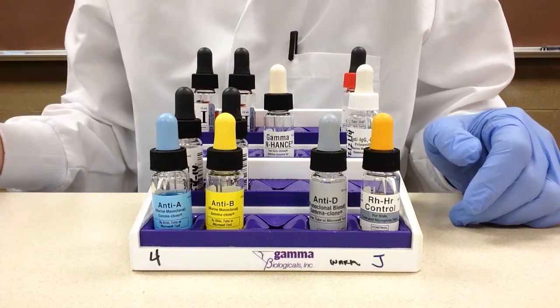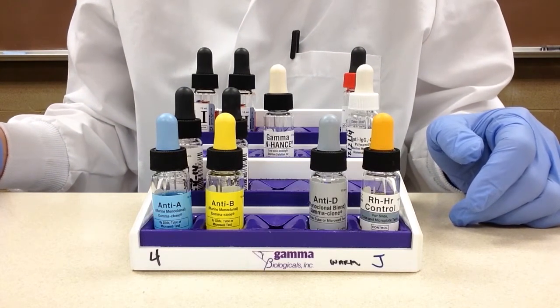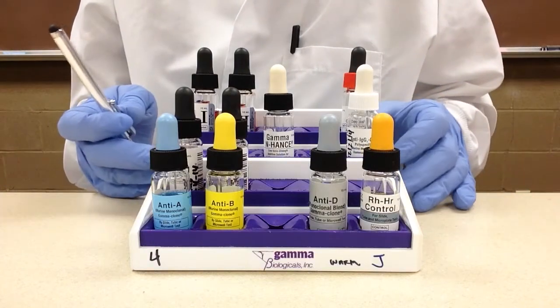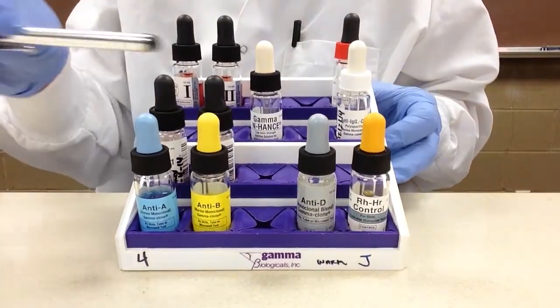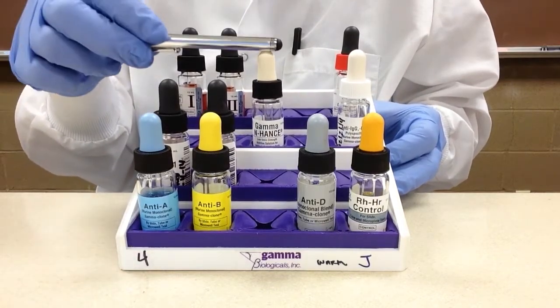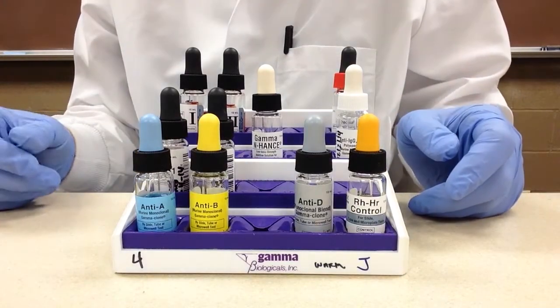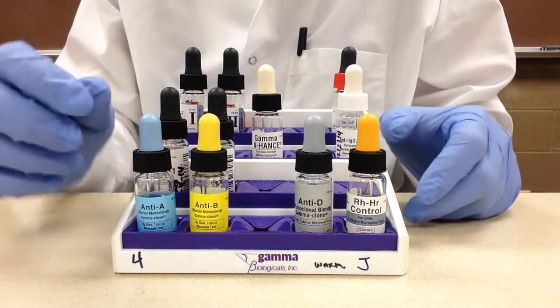The way the blood bank reagents are arranged here is that we have clear reagents, then cells, then clear cells. Now I'll go in and explain what all of these different reagents are for.